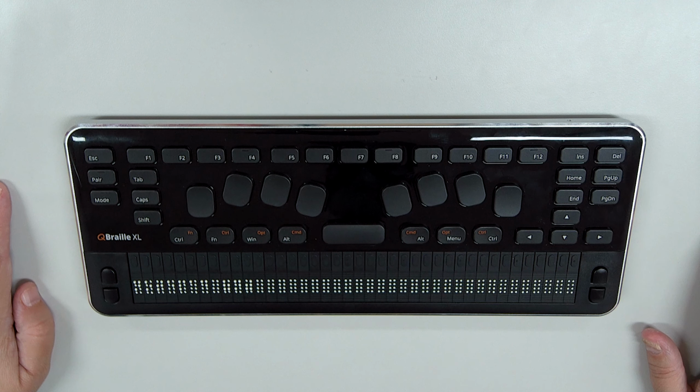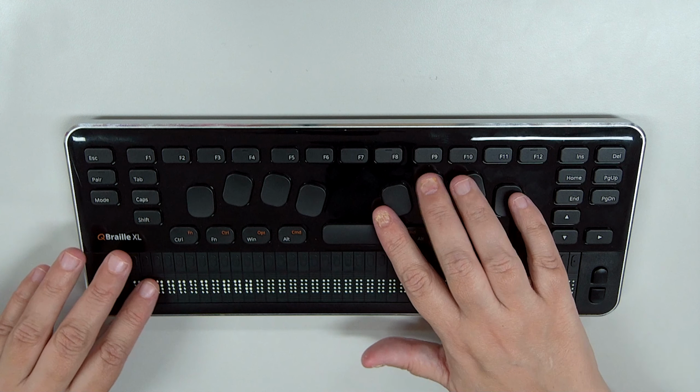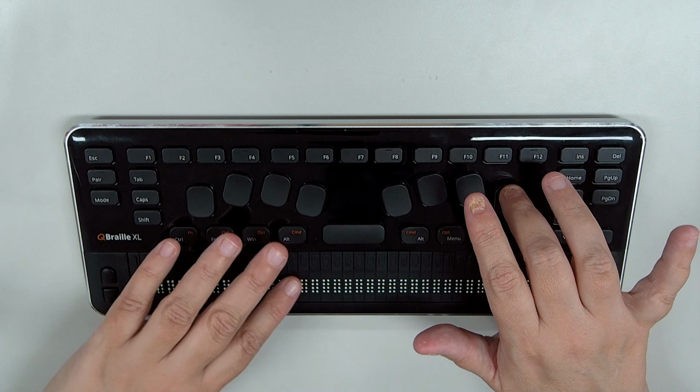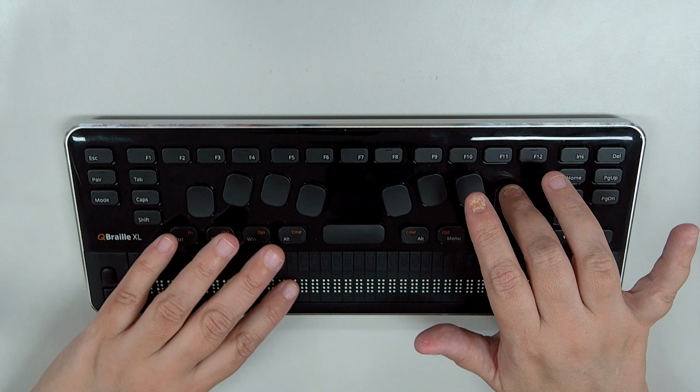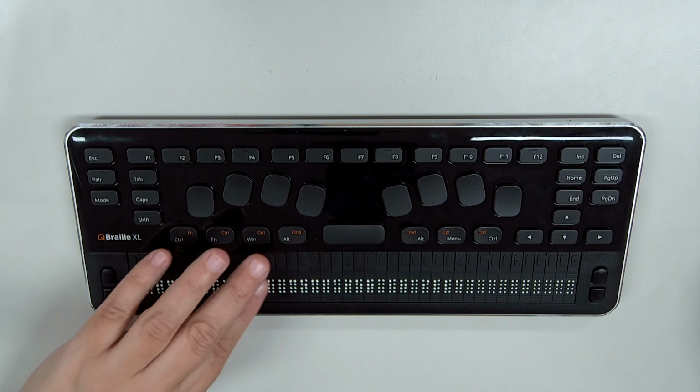In this video, we're going to take a quick look at the advantages of the hybrid keyboard. In order to do that, I'm going to connect to my PC. So the first thing I need to do from the QBraille main menu is to go to Connectivity. I'm going to press Enter. And I'm given my list of connection types. The first one is USB, so I will press Enter again to enter USB terminal mode.